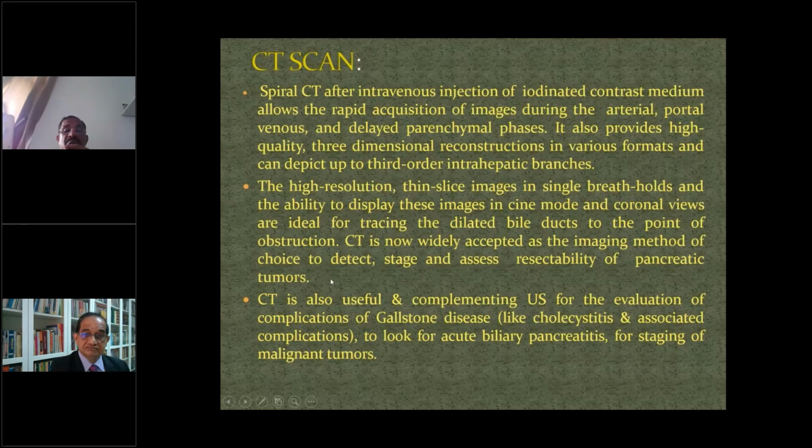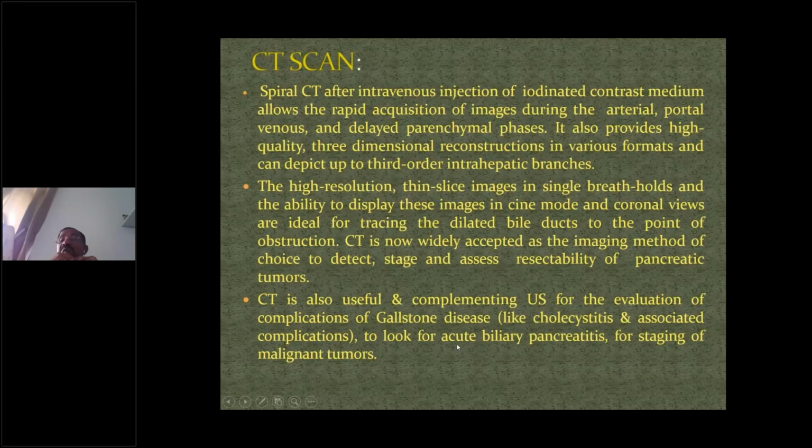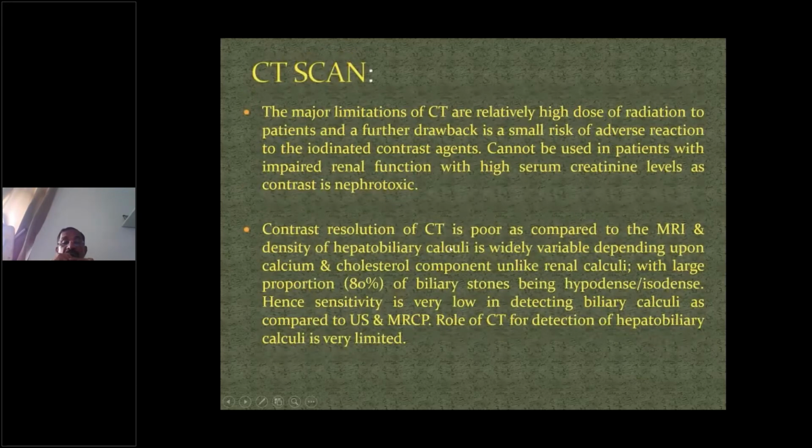tumors. And also as a complement to ultrasound for the evaluation of complications of gallstones like cholecystitis, pancreatitis, and for staging of other malignant tumors. The major limitations are that there is ionizing radiation involved, and we need to give intravenous contrast, which can lead to allergy, and those are nephrotoxic. So in patients with renal failure, contrast CT is not possible.